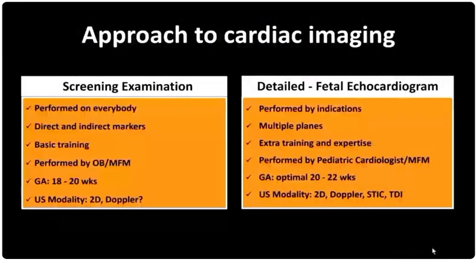Looking at the approach to cardiac imaging, I would like to highlight that it can be done in 2 different settings. One, and I think we are going to concentrate the most on this modality, is the screening examination. Without appropriate screening, those fetuses will never be able to reach the specialists in fetal echocardiography and have the accurate diagnosis before birth. The screening examination, as follows from its definition, is performed on everybody. We are looking at the direct and indirect markers. People who perform this exam have a basic training in ultrasound.